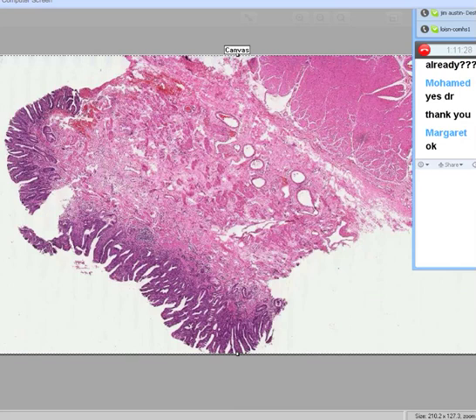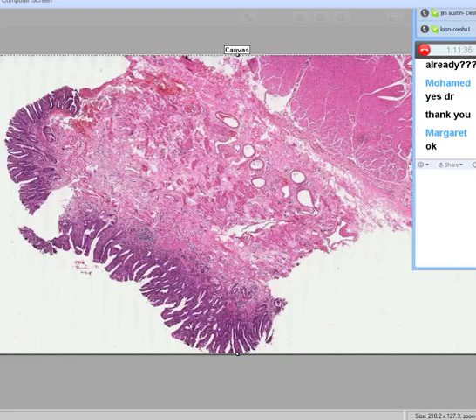And this is an extremely easy diagnosis. For example, let's say that we went through our usual algorithm and we first tried to identify what part of the GI tract this was. Well, the first thing you would think of when you saw this glandular type of mucosa is, this is not esophagus.